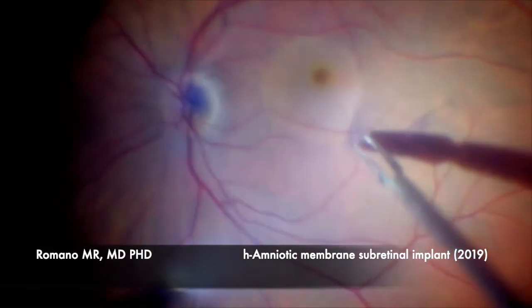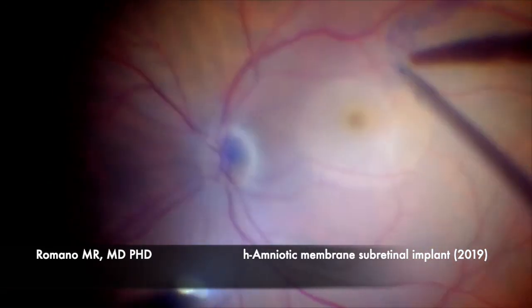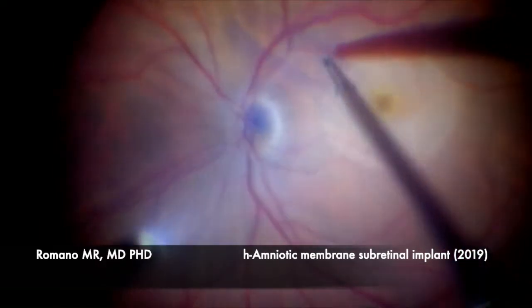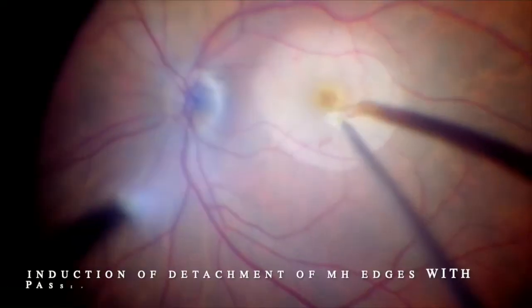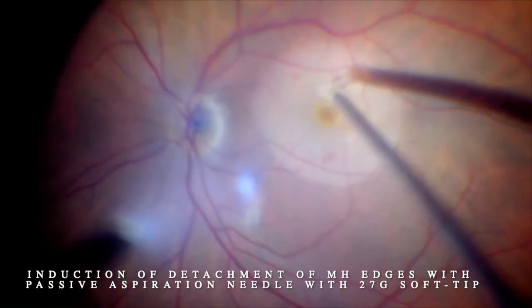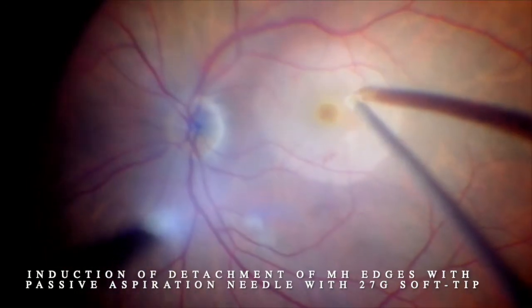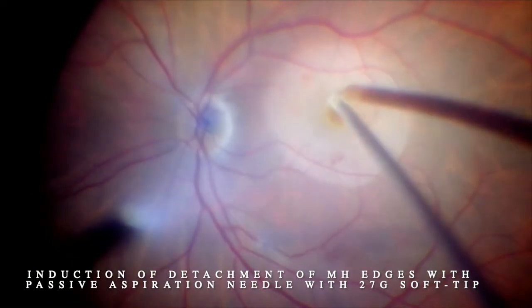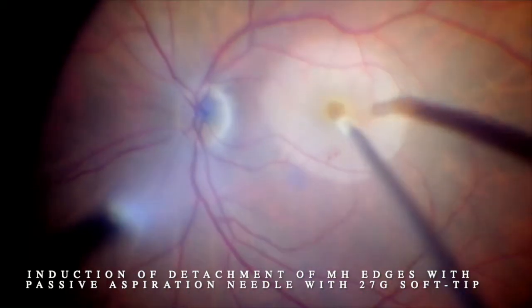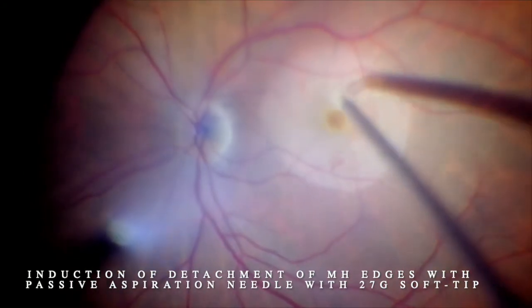Why are we using the human amniotic membrane? First of all, it can work as a scaffold for horizontal gliosis and proliferation of glial cells, because it can be the key to the interaction of activated Müller cells with the new basement tissue. At the same time, the implant can work as a plug, closing the communication between the vitreous and subretinal space. The aim is to fill the macular hole with the flat flap, also reducing the shear retinal stress on the edges of the macular hole induced by ocular movements.